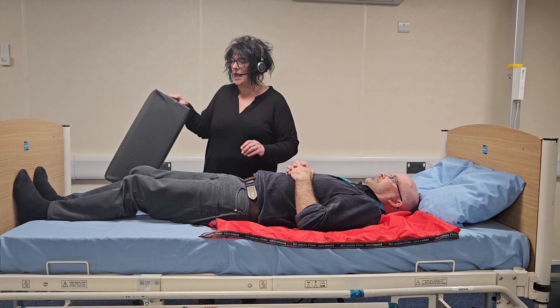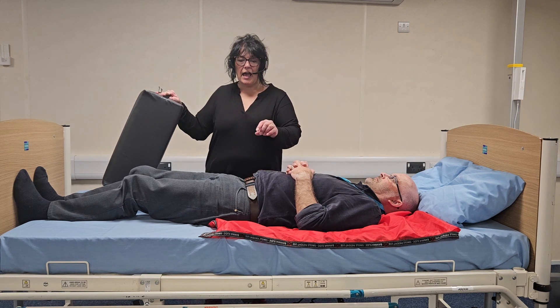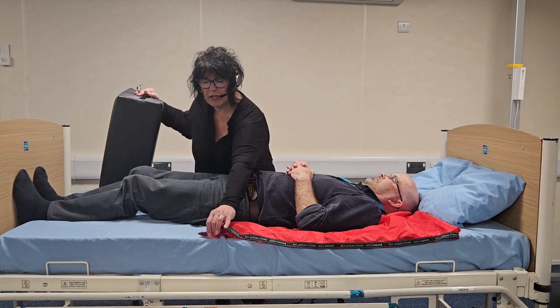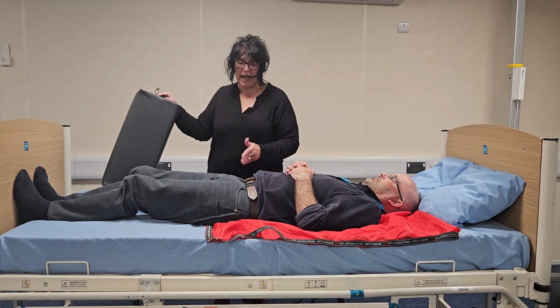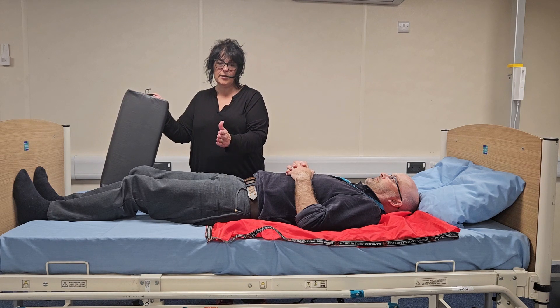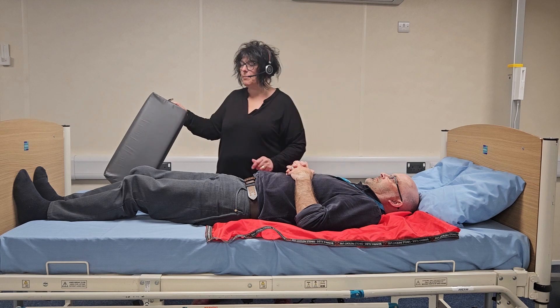We've fitted the slide sheets — I've used one flat slide sheet folded in half to achieve that slide. As you can see, it's been fitted at the position of the hips and the shoulders.